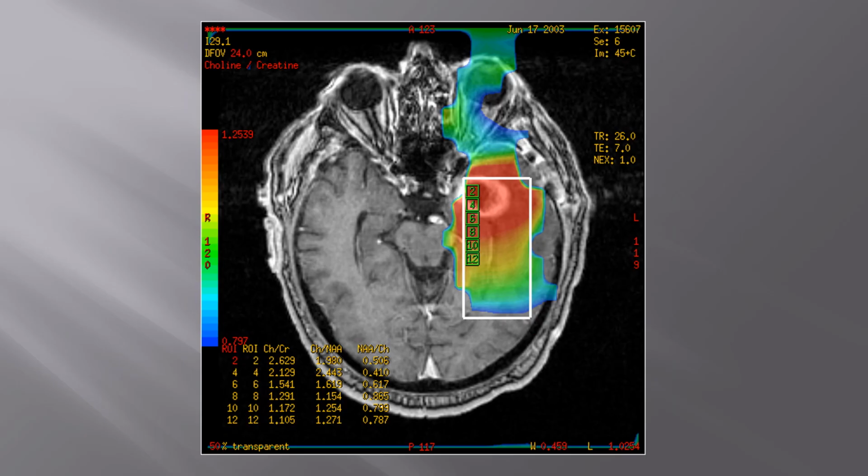Here we have an example of chemical shift spectroscopy, or multivoxel spectroscopy, kind of pushing the resolution here. We did get a great signal in this case, and overall, what we're looking at is a color-coded choline/creatine map. Where it's redder, you have higher values versus lower values. So the main concern would be MET or glioblastoma. Less likely to be an abscess given the thick rind. Some abscesses do have thick rinds, and so then you can actually look at the ratio numbers here as you go from within the lesion to outside of the lesion.